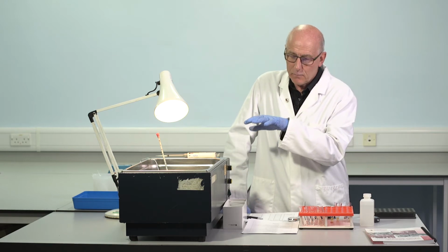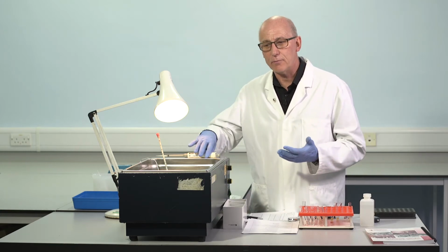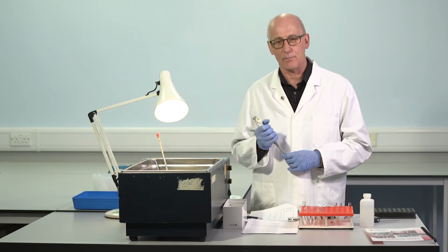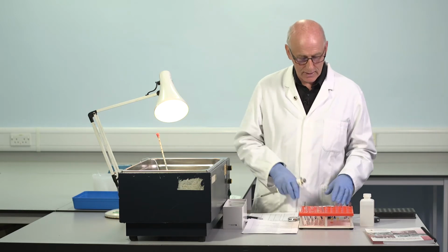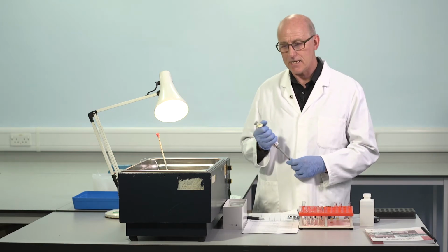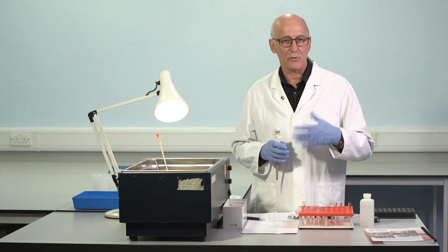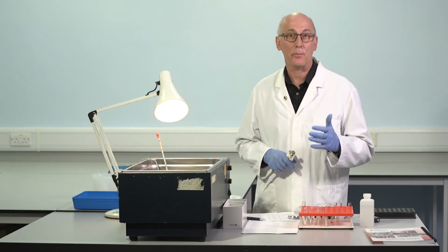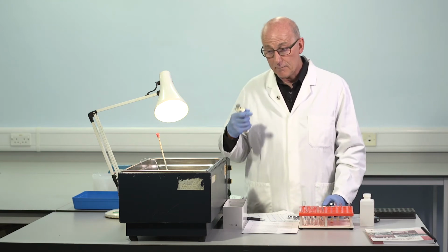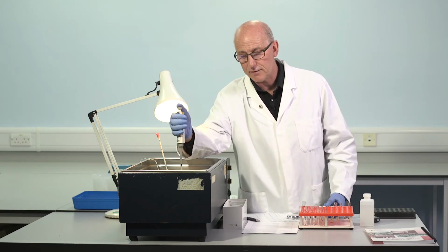We're running our tests just now in the water bath. Of course, the majority of factor VIII assays worldwide are currently performed on automated systems. And there are many advantages to this. Automated systems usually are a little bit more precise, a little bit more consistent. It's possible to process samples more quickly, so there is less opportunity for change in the reagent system. So there's a number of advantages. And many of these also will allow automated calculation, and that's also an advantage.